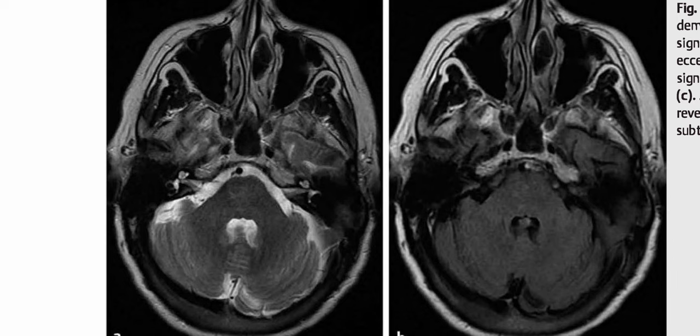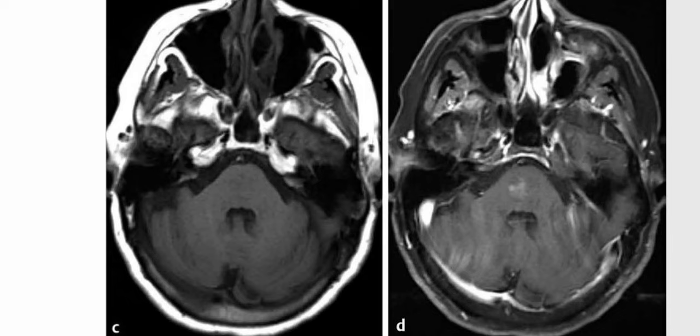There is no appreciable signal abnormality on the pre-contrast T1 weighted sequence. However, here on the fat suppressed post-contrast sequence, you can see that there is an ill-defined enhancement in the region of this subtle T2 signal abnormality.